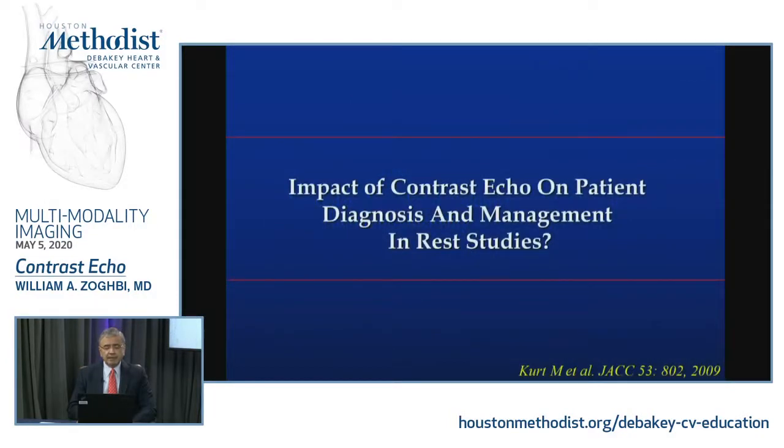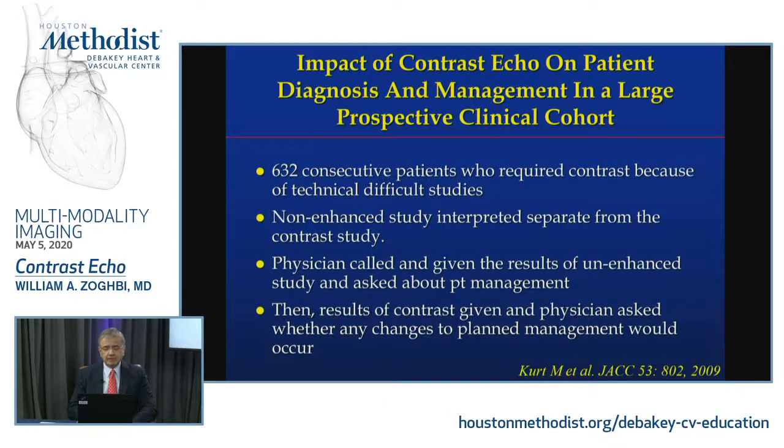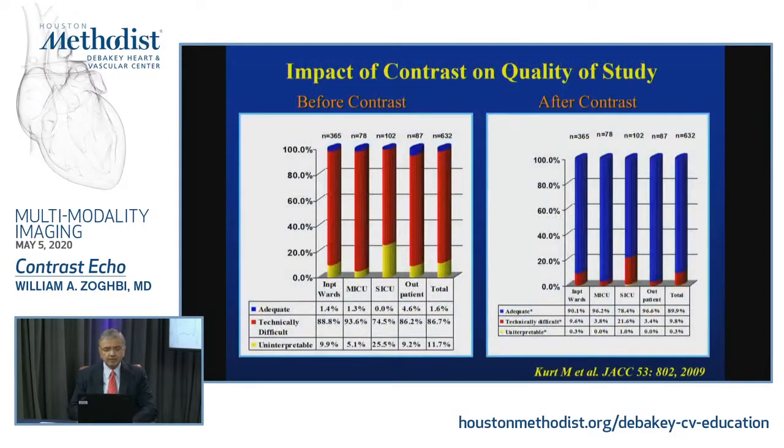What is the impact in resting studies? This is a study by Dr. Kurt, who came to us from Turkey. A very nice study that he did on 630-some consecutive patients, where we asked the question whether contrast will change management. This is a resting study, not stress, published in JACC.